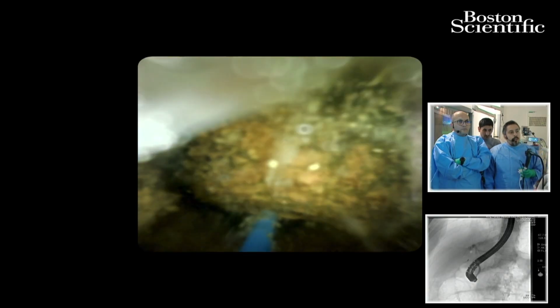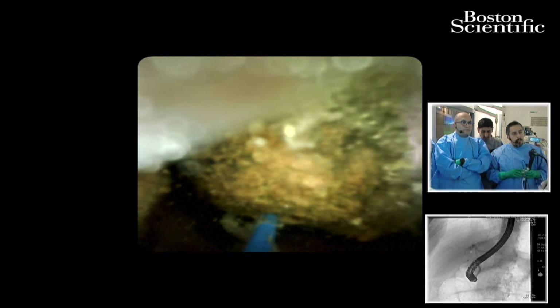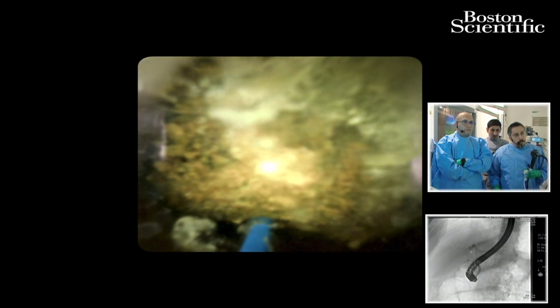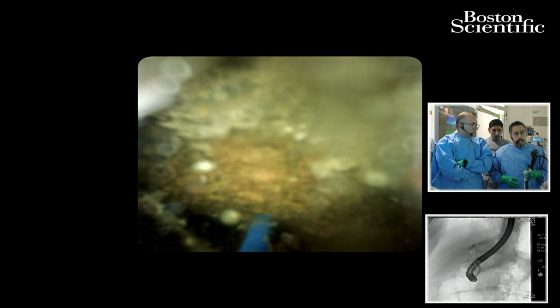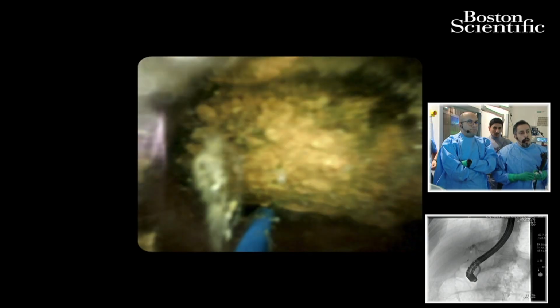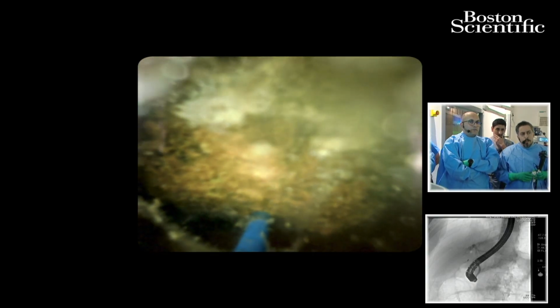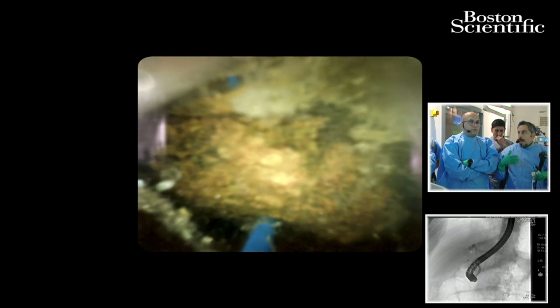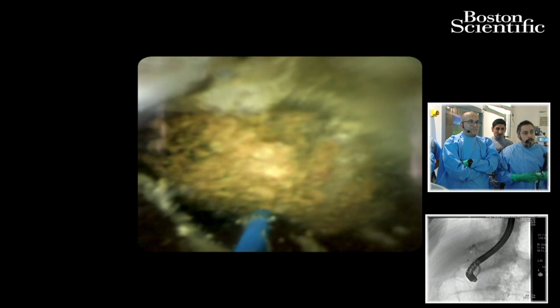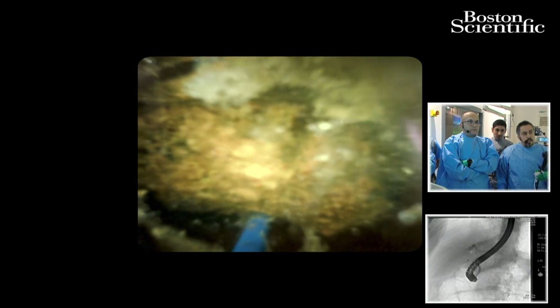Yeah, when I use a cholangioscope, I try my best to finish the job and get the job done in one single session. I don't try to have multiple cholangioscopy sessions. However, it's case by case. You might have some complex case, multiple stones, multiple intrahepatic stones, where you really cannot do the job in one single cholangioscopy session. I try my best not to open one cholangioscope at a single time because it's probably not cost effective. But again, it's an individualized decision, and it's case by case.